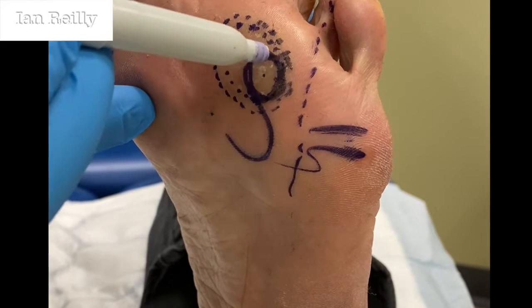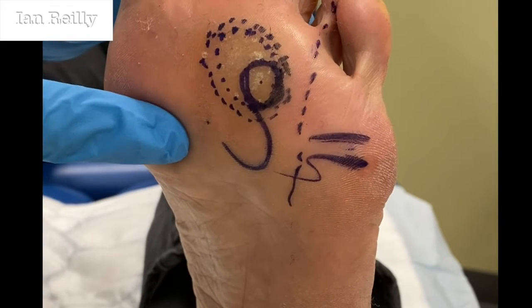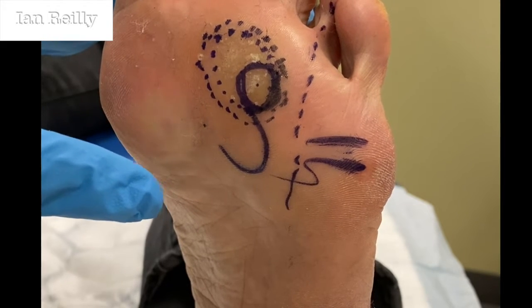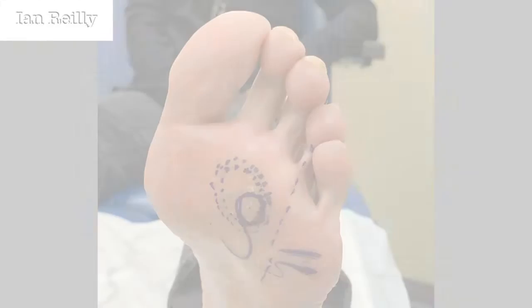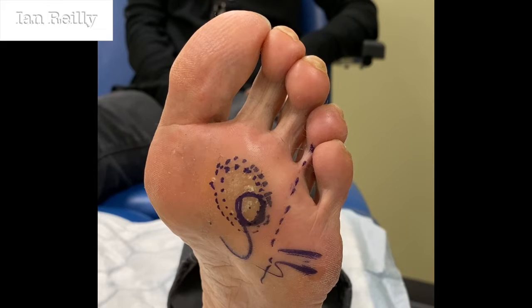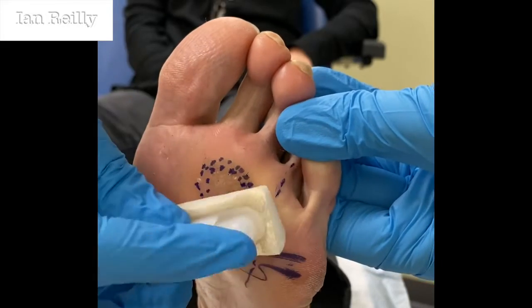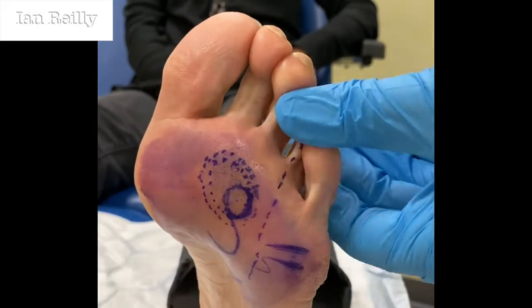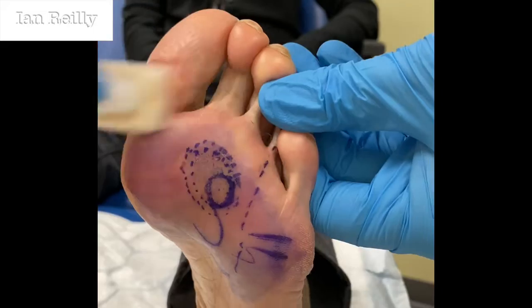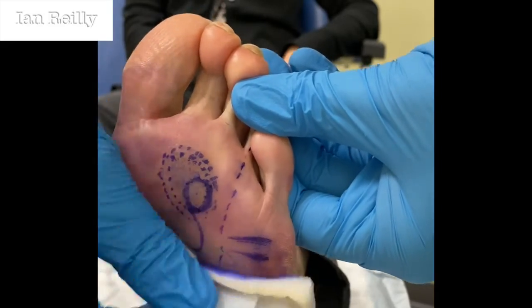I'm going to come from the top of the foot and do a local infiltration from the dorsum. I'll leave the video running while I prepare some local anaesthetic — we've done consent, and we'll do skin prep now. So I'm doing a little bit of skin prep — it's not a very invasive technique but it is invasive, there's always a slight risk of infection. That's all gone nice and purple now — so we might give you a little bit of a purple tattoo there, Chuck.